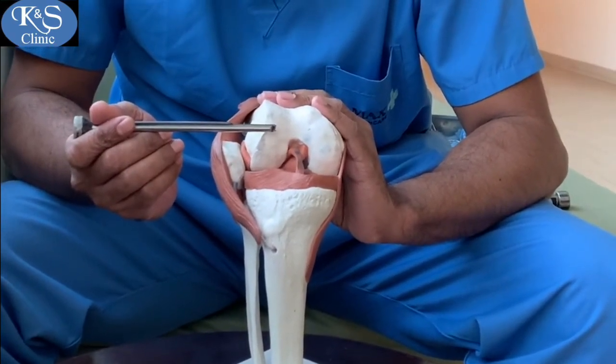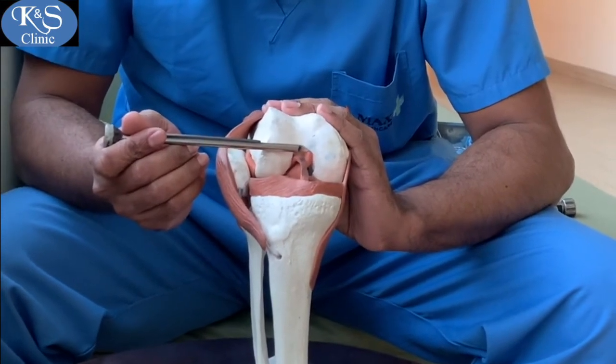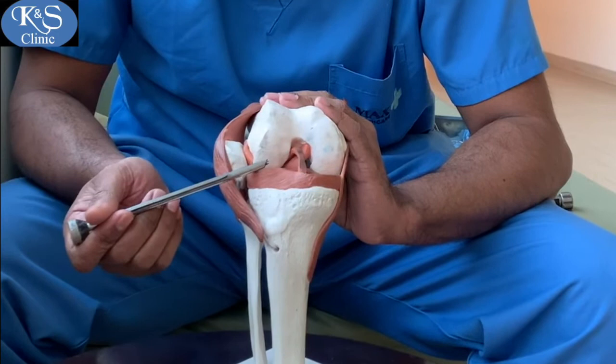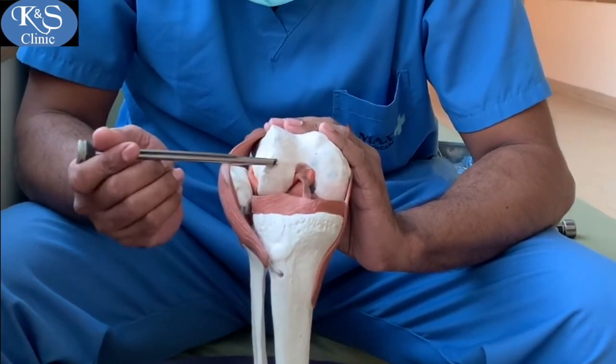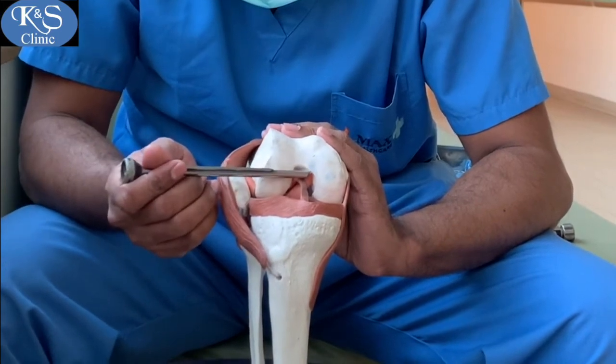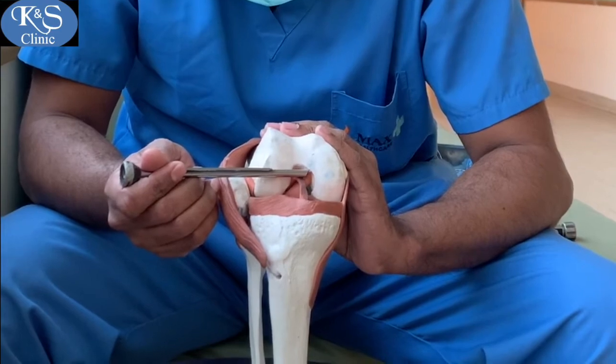A low anterolateral portal is used to drill at the femoral footprint. This gives an end-on view of the medial aspect of the notch and the PCL footprint.